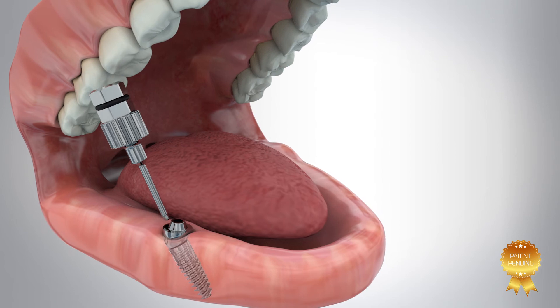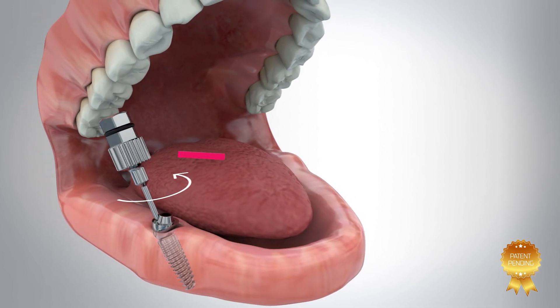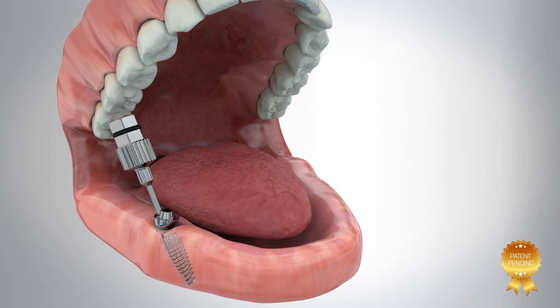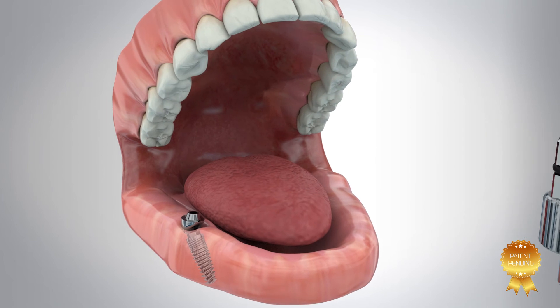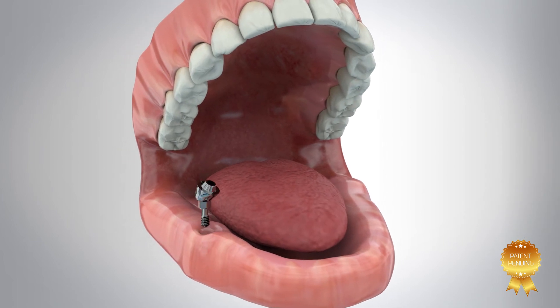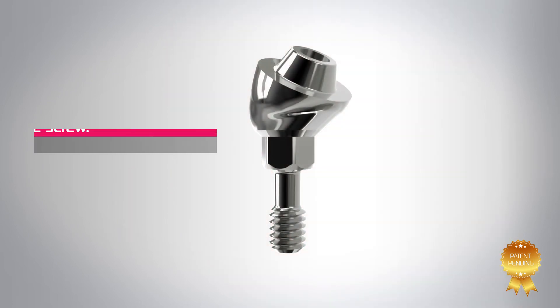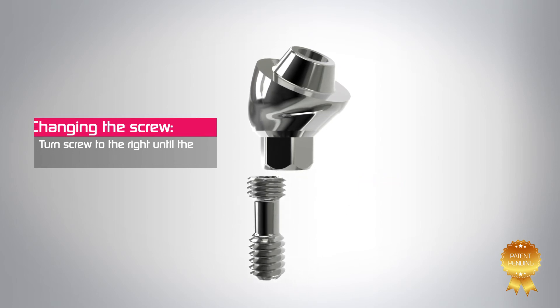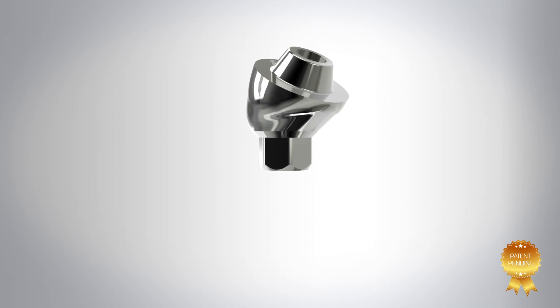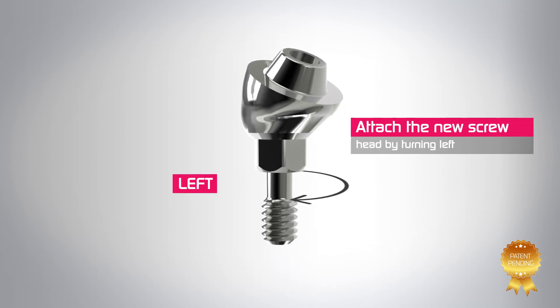In cases where a screw replacement is required due to maintenance or breakage, detachment of the abutment is done using the angulated multi-unit key. Detachment of the abutment screw from the abutment is done by turning the screw to the right until the screw head clears the abutment hex and the screw is free. The new screw is attached by screwing the screw head into the abutment hex turning left.